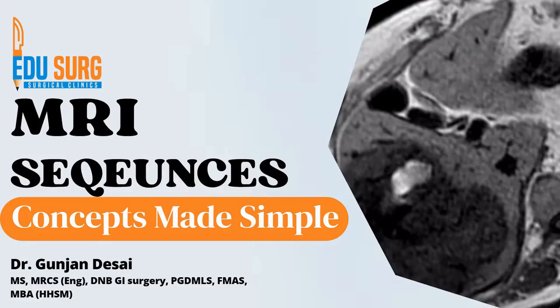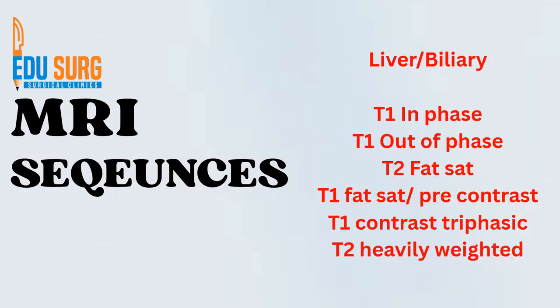Now, like I said, we want to learn the sequences and why various sequences have been generated. And this is something that we need because we want to see liver MRIs and we want to see rectal MRIs. And you will see these many plates in the folder of MRI. And the simplest thing you will do is read the report. But in the next part of this series, that is the sequences, you will see what is T1, what is T2, what is in phase, out of phase, fat set, and the triphasic contrast, which is more or less like a CT scan, and heavily weighted T2, which is the MRCP. So these are the sequences that are basic when you want to learn MRI, and we will see that in the next part.